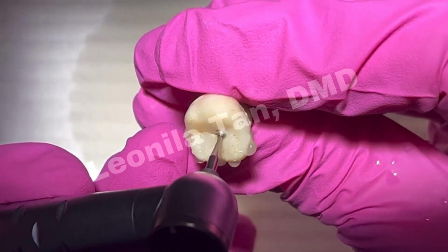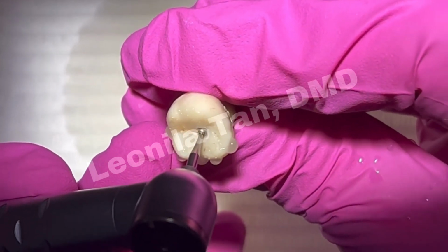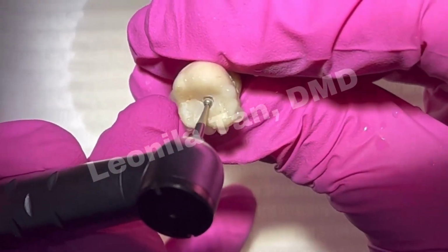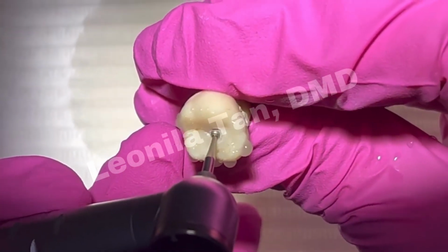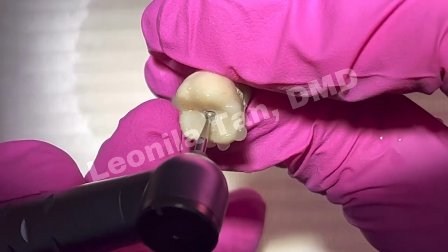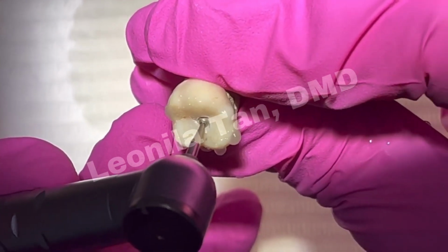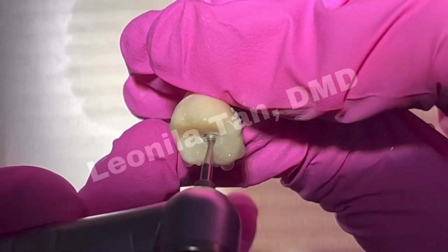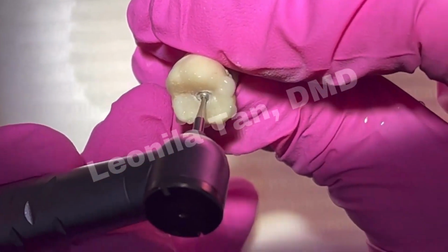Now, to avoid having friction from the shank of the burr, you can just open a little bit as you direct your burr palatally. So it's a touch and go motion. Notice I am keeping the angulation.